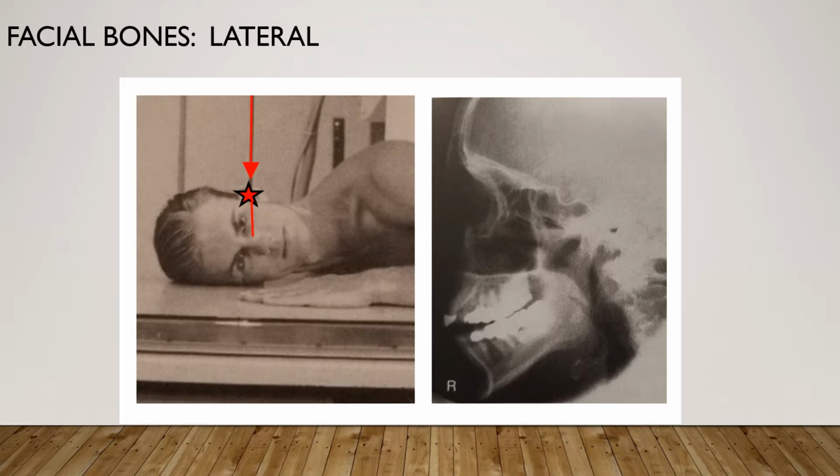The region from the orbital roofs to the mentum is going to be demonstrated. There is no tilt evident by superimposition of the orbital plates or the roofs. No rotation evident by the superimposition of the greater wings of the sphenoid and mandibular rami. Optical density, brightness, and contrast to visualize facial structures. And you're going to have sharp bony margins with no motion.